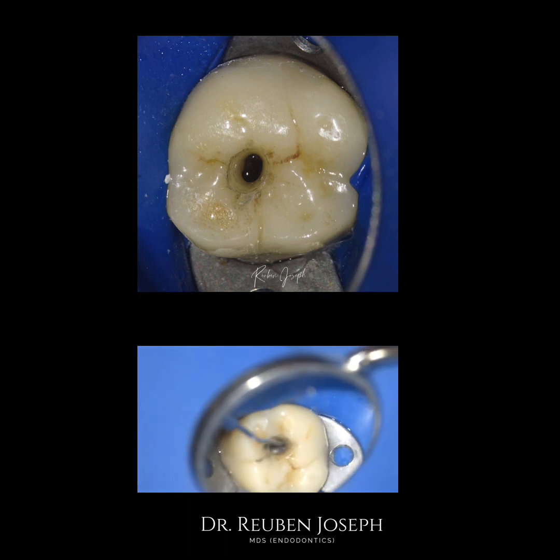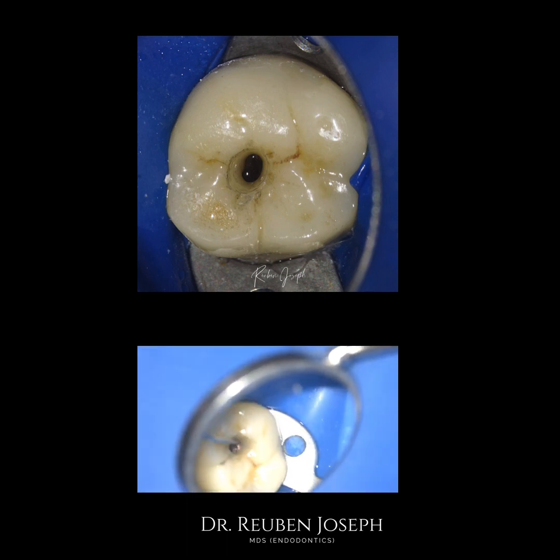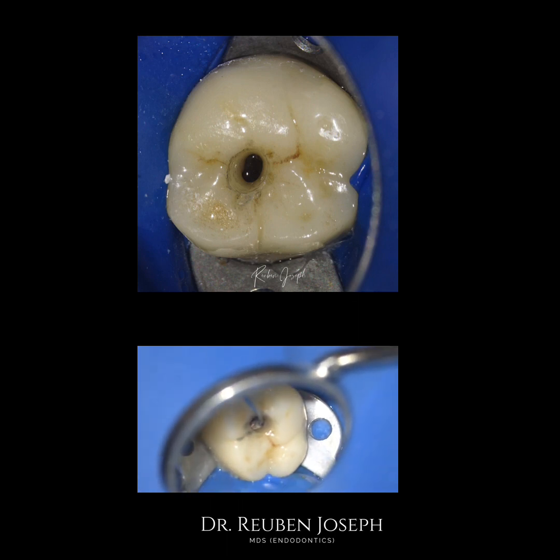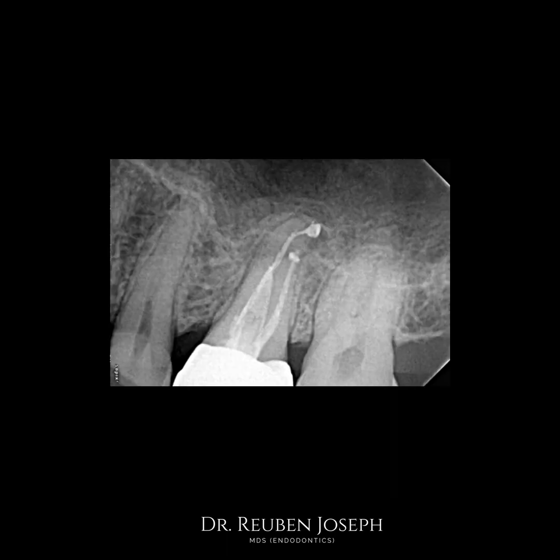As you can see, very little amount of the tooth structure or the crown has been removed to gain access to these canals. So there is absolutely no reason for changing this crown even in the future. So that's the finished post-operative radiograph. We completed this case in a couple of visits and at the end of which the patient absolutely had no symptoms at all.